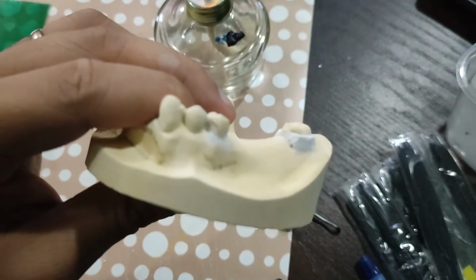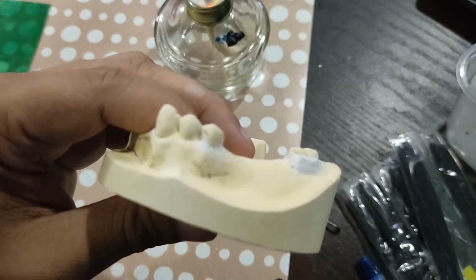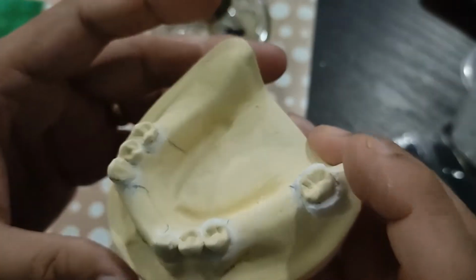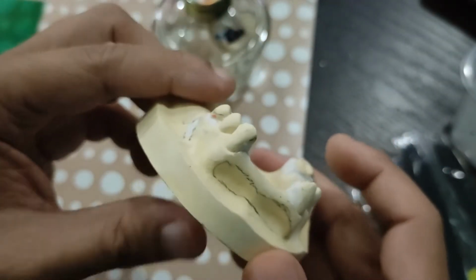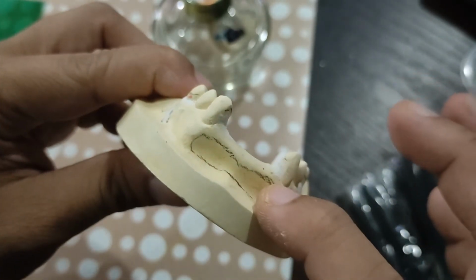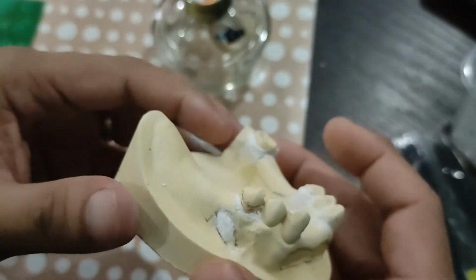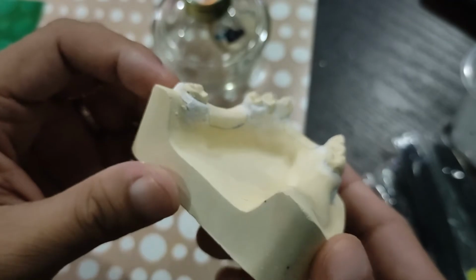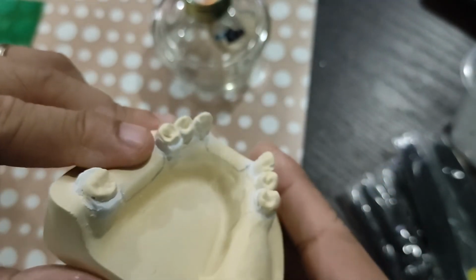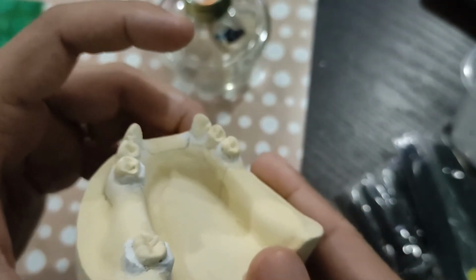Okay. There we go. Right? I'll block this out eventually with, since there's no components that's going to cross here, we will do arbitrary blockouts here. But we'll do that a bit later. I've also outlined where the denture base will terminate. Okay.